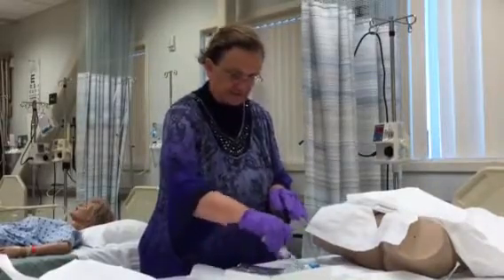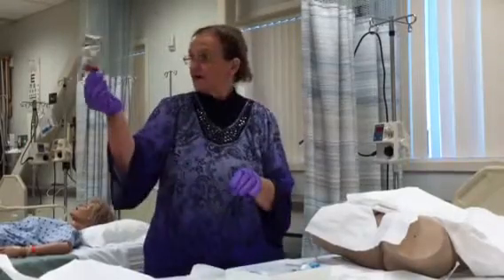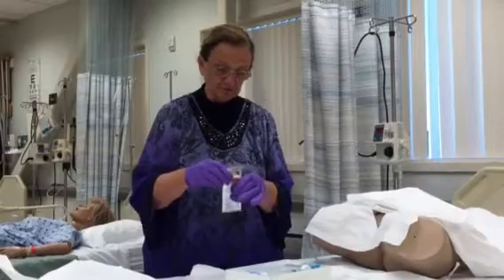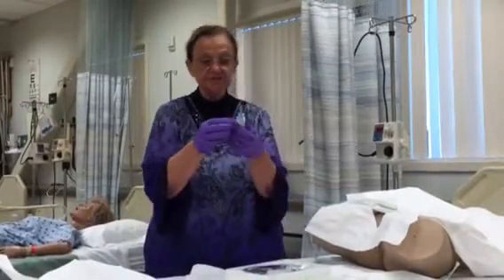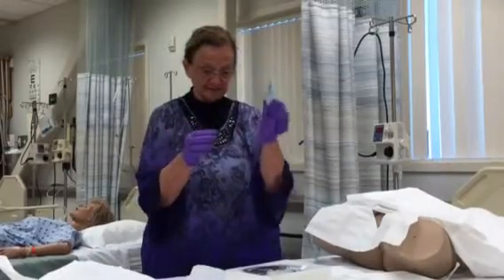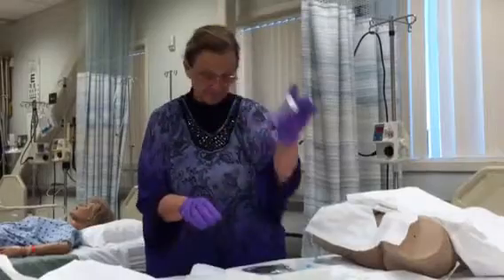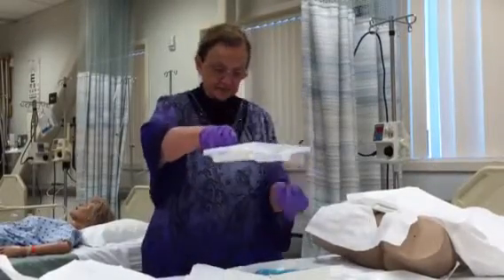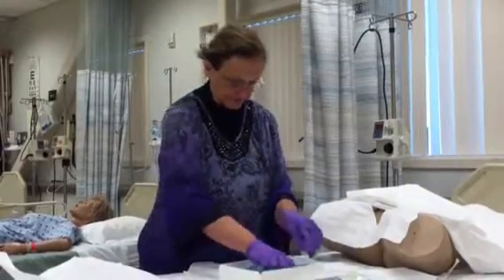Now, what comes in this kit is a syringe in which I'm going to check my catheter balloon, betadine, which I'm going to use to moisten my swabs, and you want to be sure your patient is not allergic to betadine. Oh, this is very cool, this lubricating jelly. I've not seen it like this before. And then if you need a urine specimen, that's coming in. So I'm just going to take this entire upper tray and set it aside for my use.